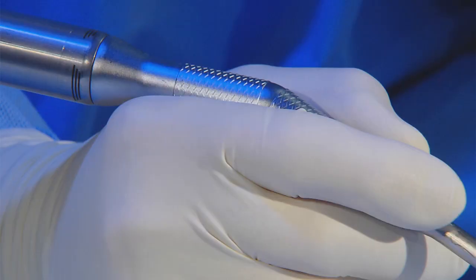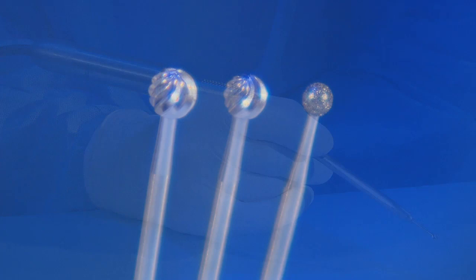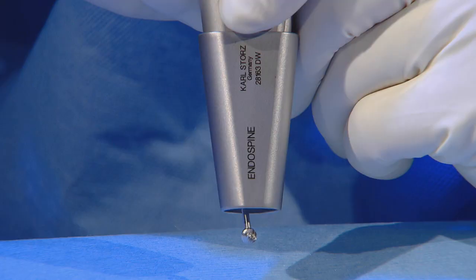The endospine system can be combined with the UniDrive, which is a high-speed motor with burrs. In this case, the endospine acts as an end stop, which is very comfortable and reassuring when reaming, because you can be sure there is no risk of slipping into the vertebral canal.